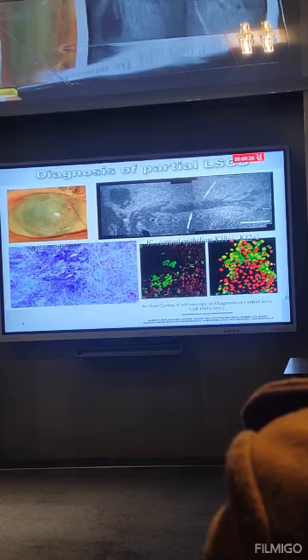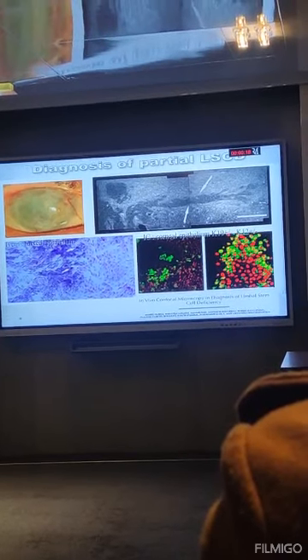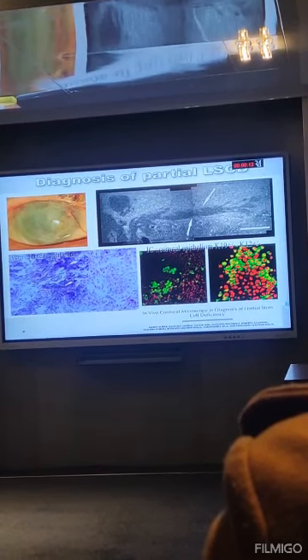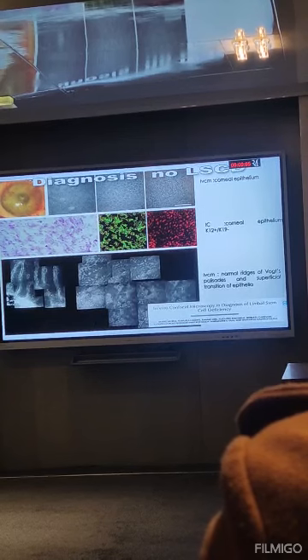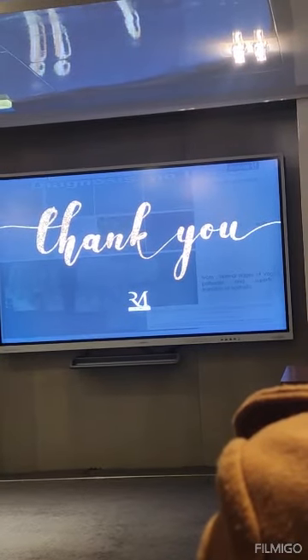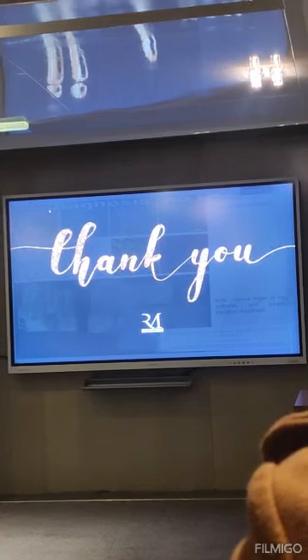In this case, you think it's total because it's all white with almost total vascularization, but you still see that in confocal there are islands of corneal cells. So this means that maybe you can just do a pannectomy, use amniotic membrane, and living surviving cells can do the job without doing living-related or auto transplant. And in this case, for example, with a lot of vessels, you see that it looked like a limbal cell deficiency, but it was actually a totally normal cornea with just superficial vascularization after an herpetic corneal disease.